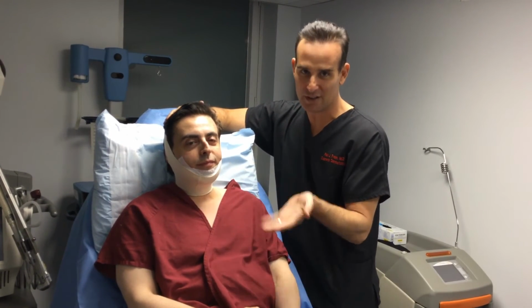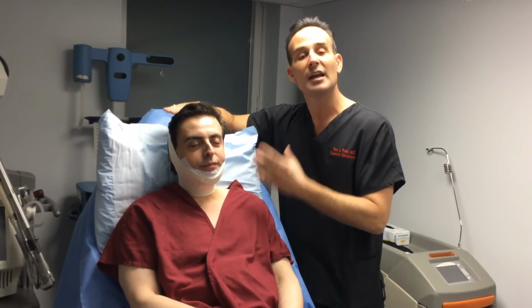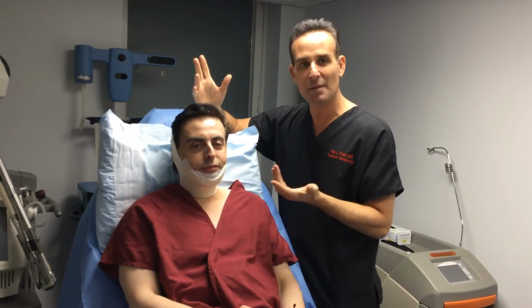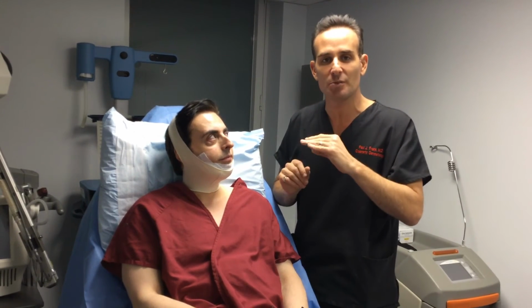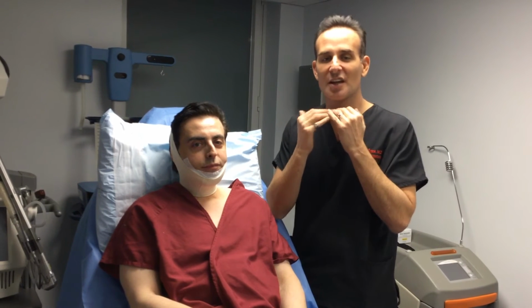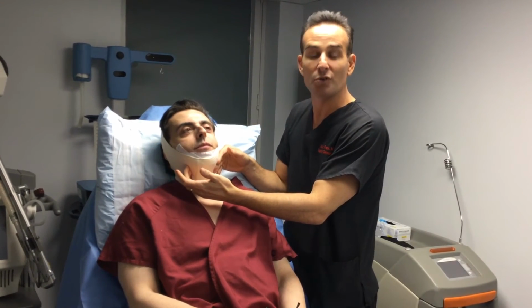He's able to eat, just no steaks or apples or anything like that. He will wear this for 24 hours. He will then be able to take off the bandages, shower, wash his hair, and then maybe for a few nights he'll just sleep with this little headgear on, just to put pressure. Right now, the first few days is the most important period. We've created like sticky tape on the inside of the skin, and we want to heal against the muscle to recreate a more youthful jawline.